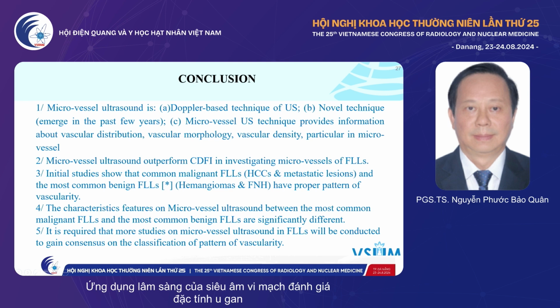This technique has been shown to outperform conventional Doppler in investigating the microvessels. And initial studies show that common malignant lesions, for example HCC or metastasis, and the most common benign lesions have different patterns of vascularity.